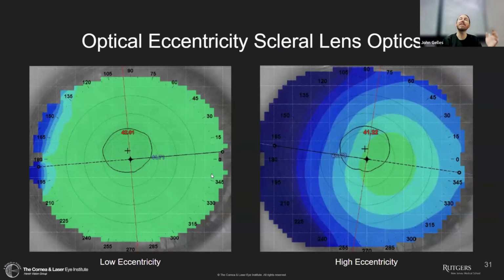So that's what we're controlling with this. But what you'll notice is the center of the lens is over here and the center of the pupil is over here. So if it was perfectly lined up with the visual axis, if we're changing the eccentricity, all we're changing is the spherical aberration. So there's no customization to be able to control the coma or trefoil or anything like that.